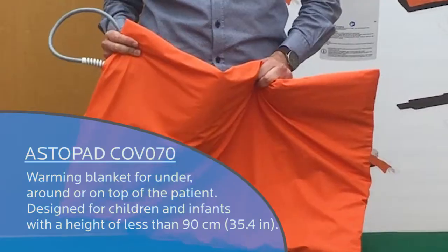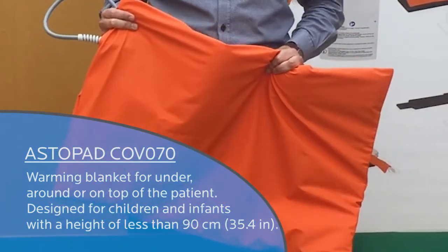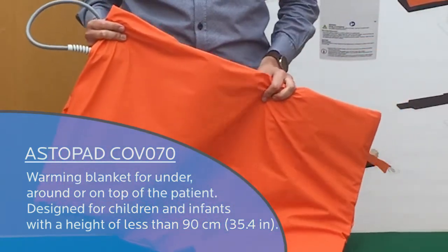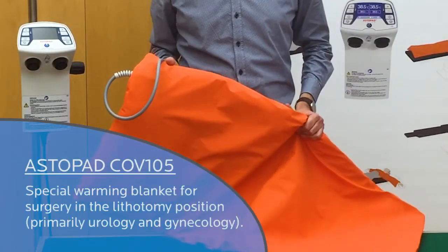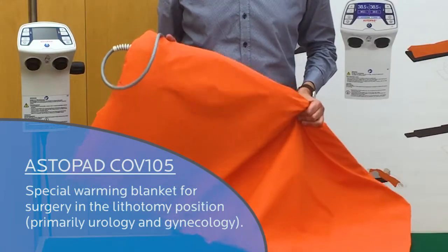To customize the application of blankets to specific patient positioning needs, there are several Astopad blankets available. The Astopad COV-070 warming blanket is designed for use under, around, or on top of the patient, for children and infants with a height of less than 90 cm (35.4 inches). The COV-105 is a special warming blanket for surgery in the lithotomy position, primarily used in urology and gynecology.